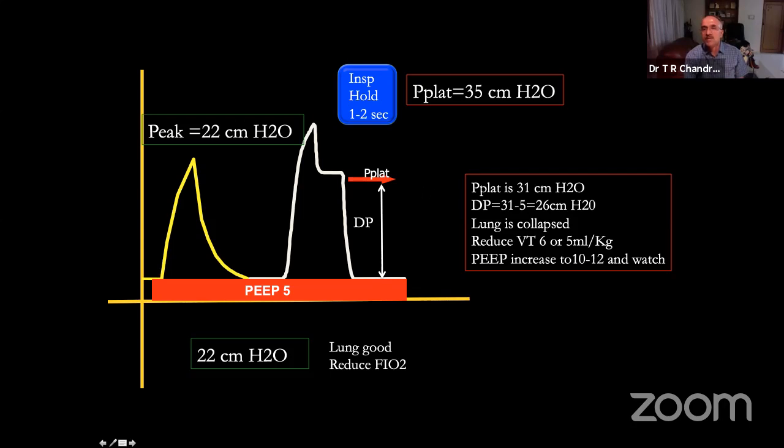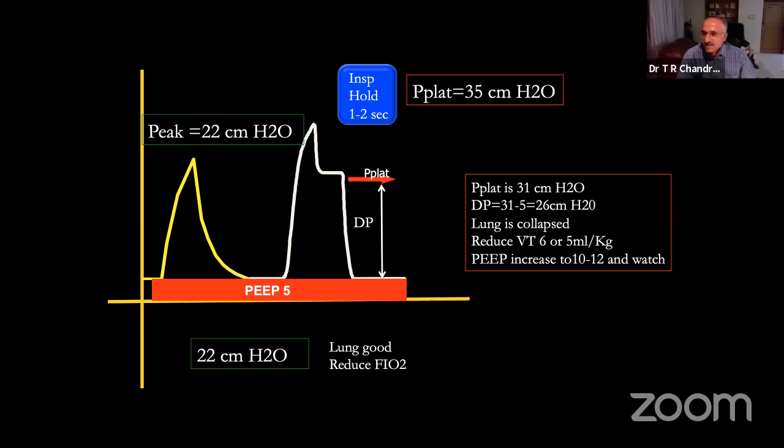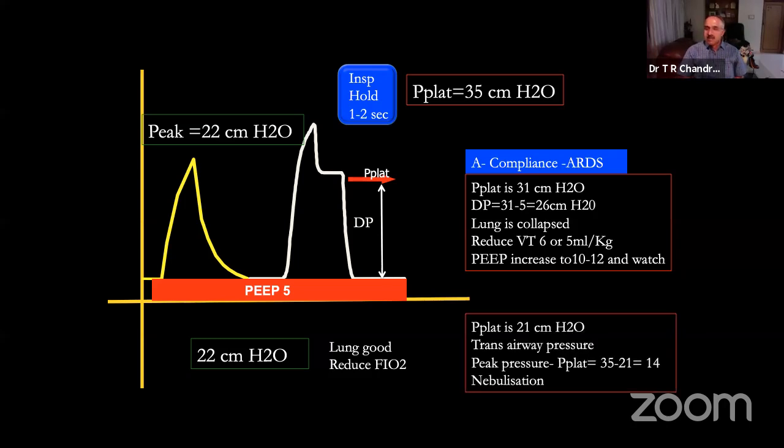Now the plateau has become, say, 29 at 10 PEEP. Are you happy? Yes, sir. That is how you work, isn't it? That is what I want you to understand. It's an ARDS issue. Trans airway pressure.